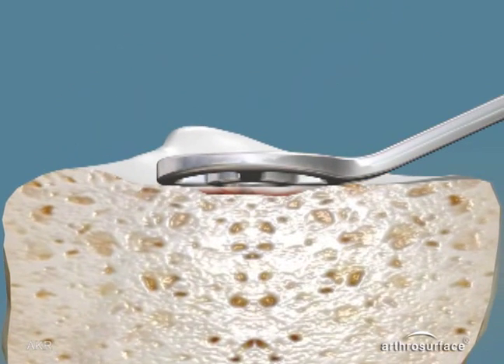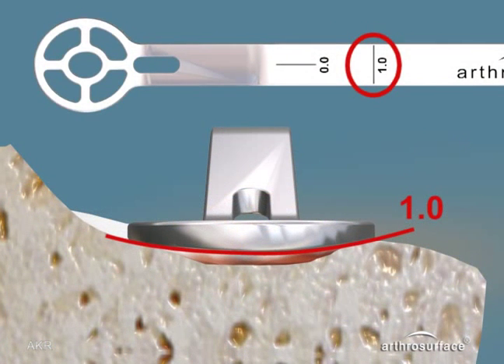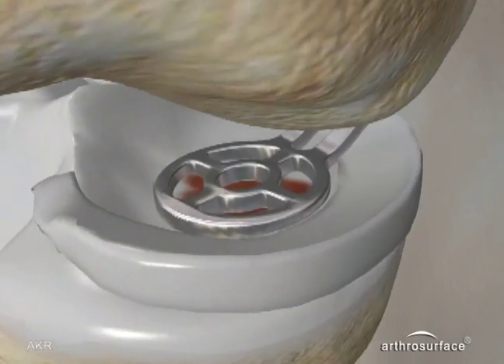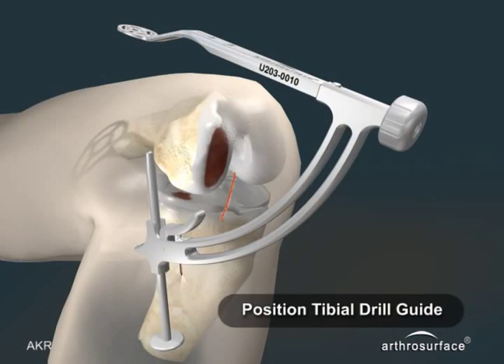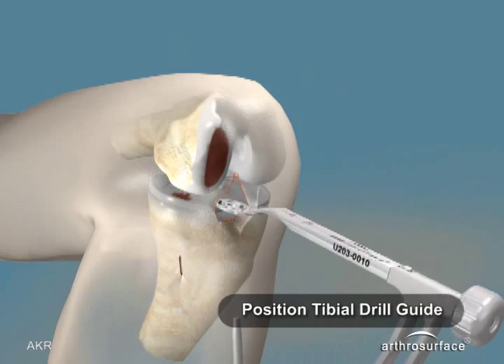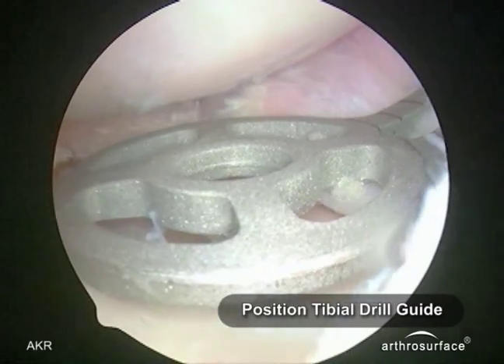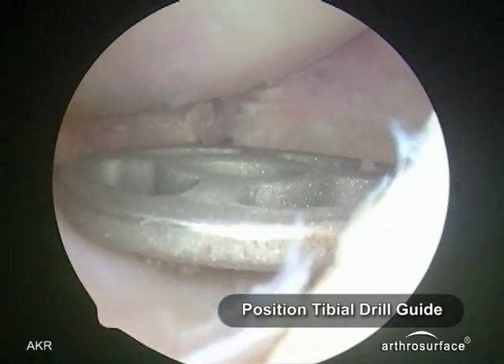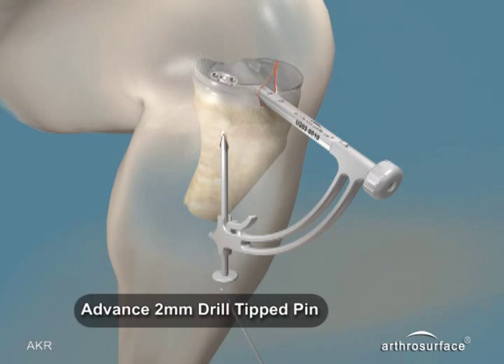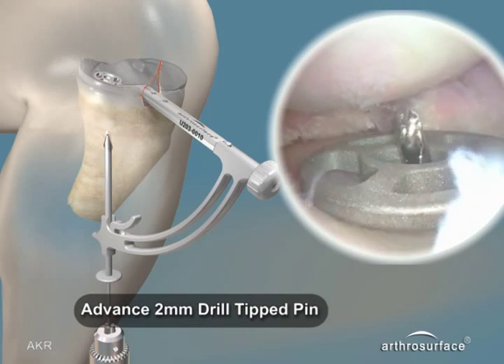There is a selection of tibial templates with different curvatures in the anterior-posterior and medial to lateral planes, which you place over the defect, choosing the one that gives you the best recreation of the tibial plateau curvatures in both planes. Attach the template to the tibial drill guide and reinsert, creating a stab incision on the distal tibia for insertion of the bullet. Align the guide arm anterior-posterior and insert the 2mm drill tip guide pin through the bullet, exiting at the center of the tibial template.